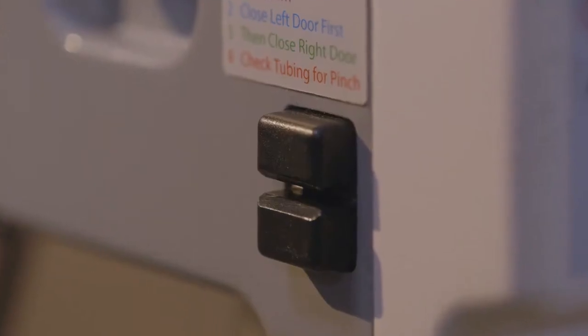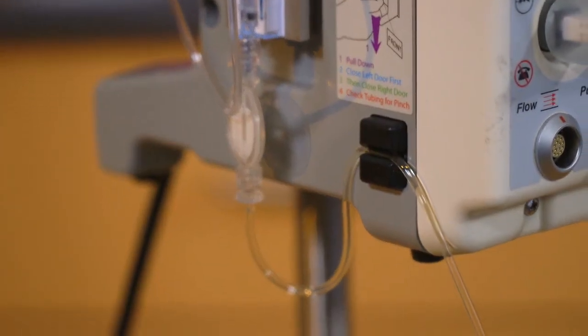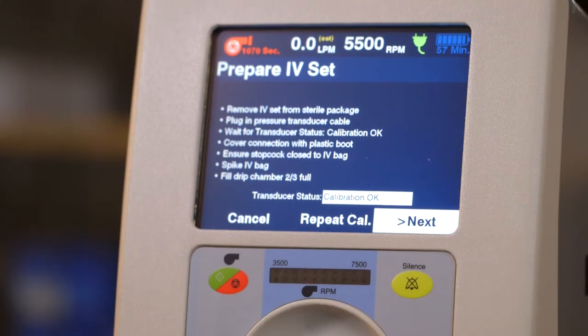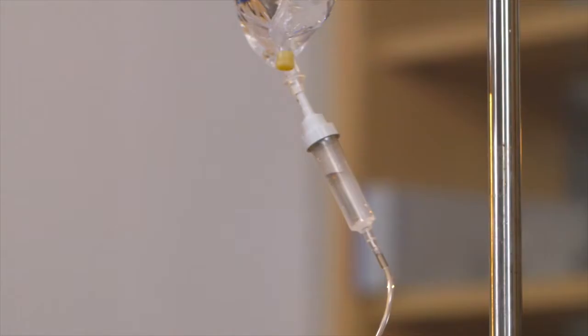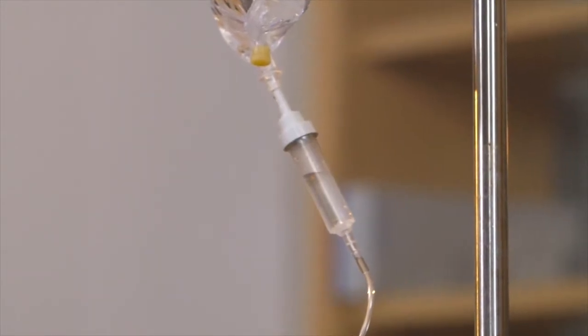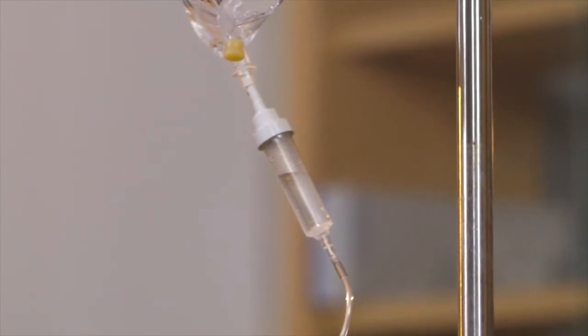The controller operator then inserts the infusion line into the air bubble detector by simultaneously pushing and pulling the pump infusion line. With the controller powered on and stop cock open, the controller operator checks for drips in the infusion assembly drip chamber.